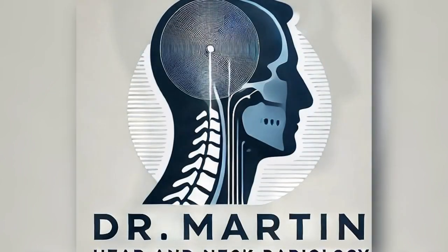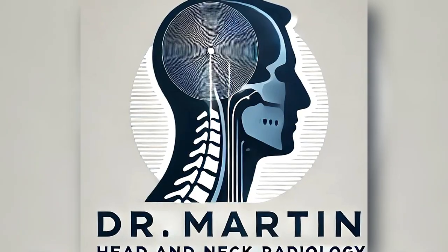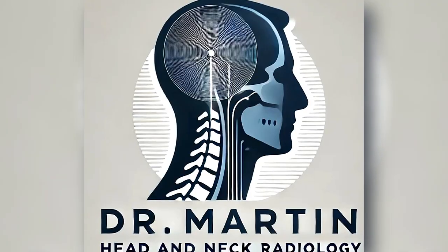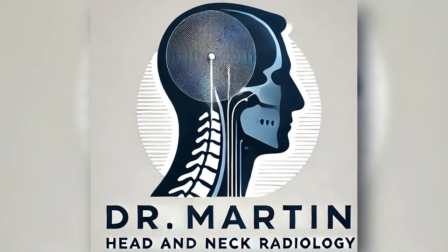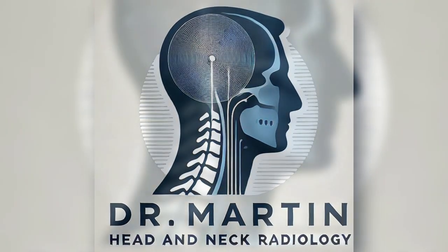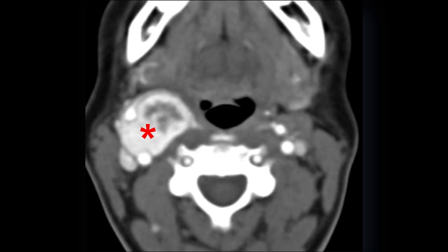In today's video, we will discuss the radiological findings of the carotid body tumor, also known as carotid paraganglioma. This entity is one of the most important lesions to recognize in the carotid space because of its characteristic imaging features and clinical implications. We will review two illustrative cases, and then go through the main concepts that every radiologist should keep in mind. Let us begin with the first case.